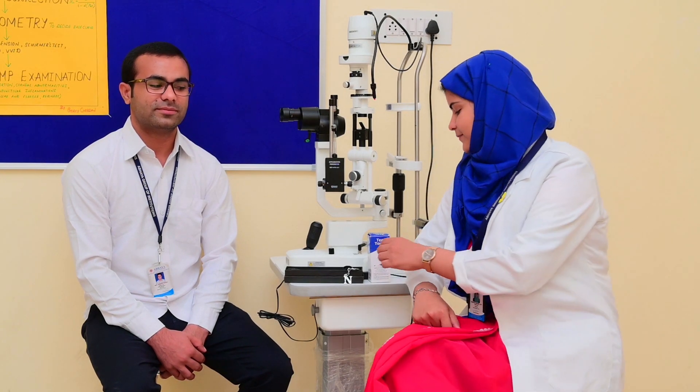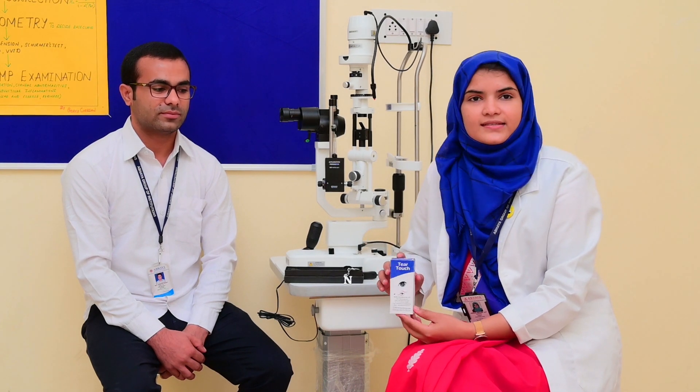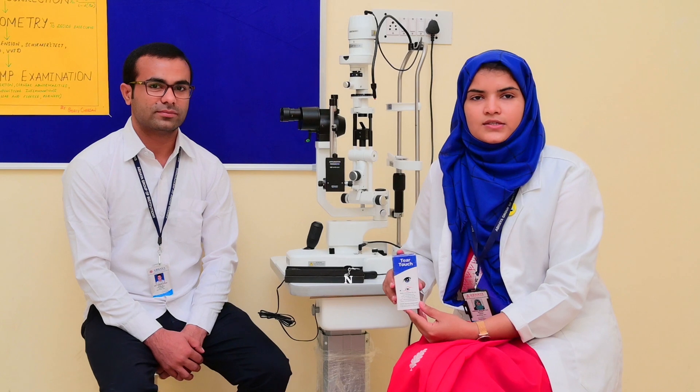Good morning, I am Dr. Nishant Begum AP. Today's practical session is about dry eye assessment. For this, I am using Schirmer strips. This is filter paper number 41, which has the capacity to absorb tears. So let's do a practical session now.